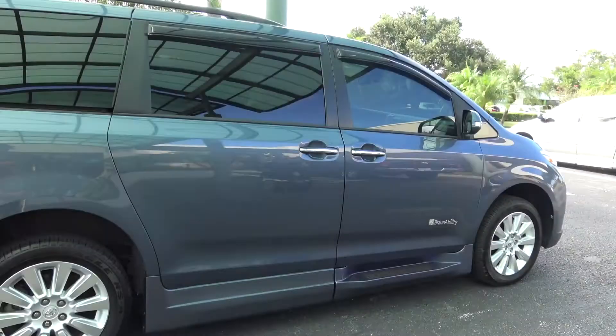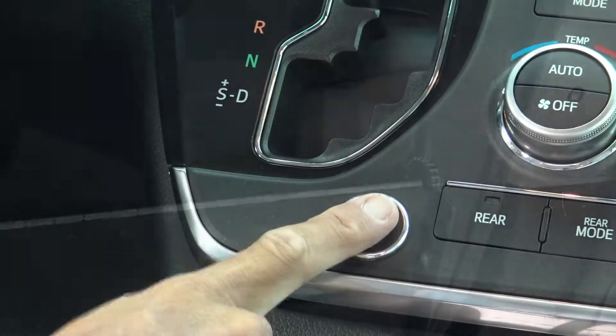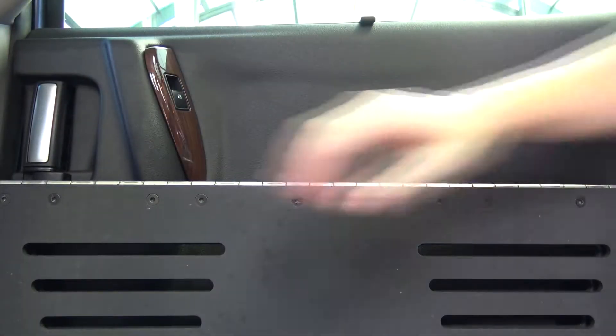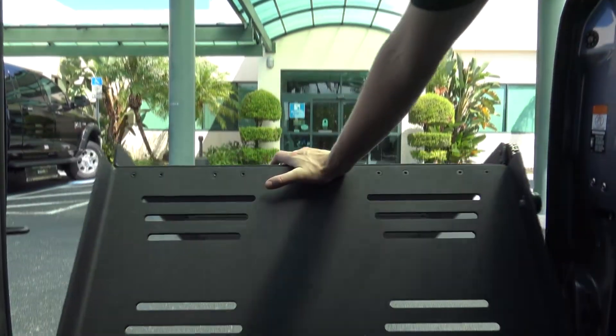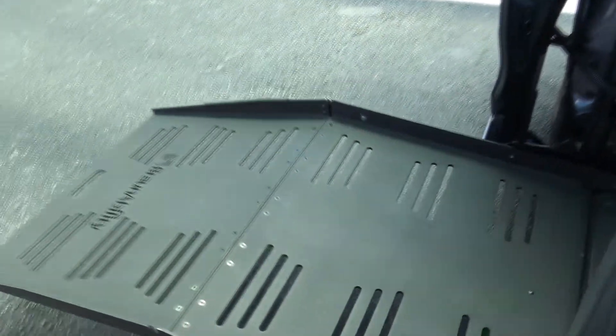If you're stuck in the van and the ramp won't deploy using either the key fob or interior buttons, first manually open the door. Next, push the ramp out using an open hand, applying steady pressure until it starts to deploy. At a certain point, it should continue its descent on its own.